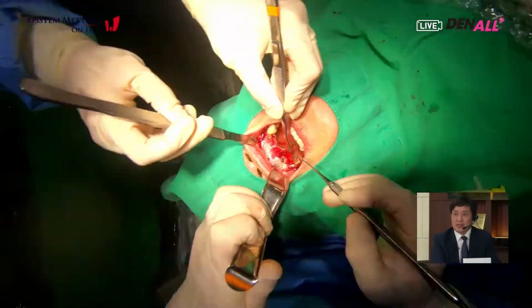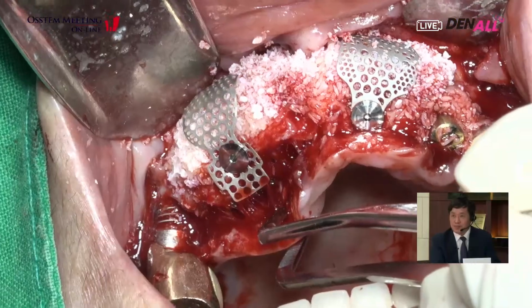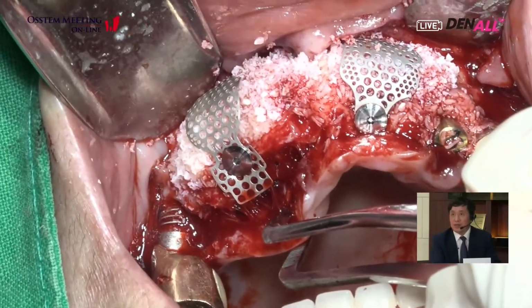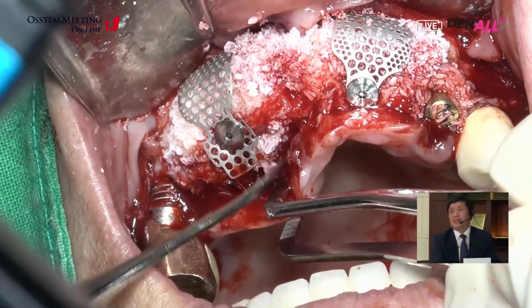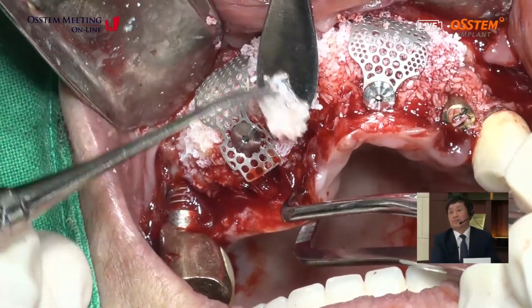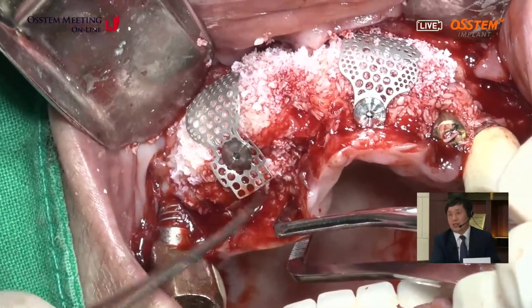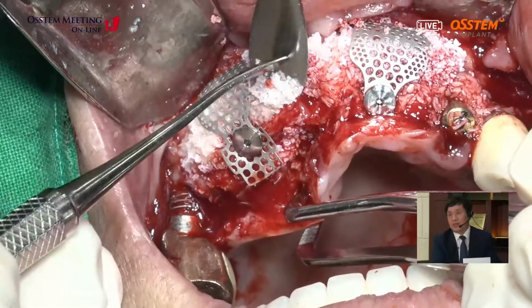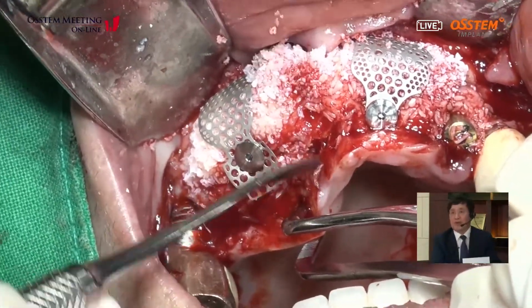And Dr. Kim applies to the palatal side of the right canine area, the 0.15 one. Is this xenogenic bone graft material? Dr. Kim: xenogenic bone graft material, bovine bone, AOS.